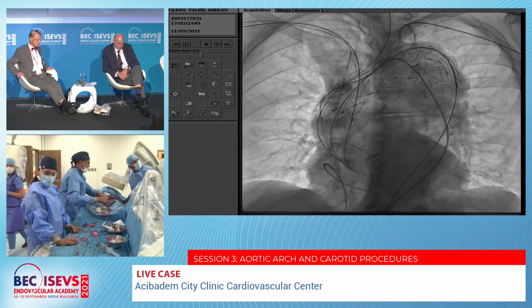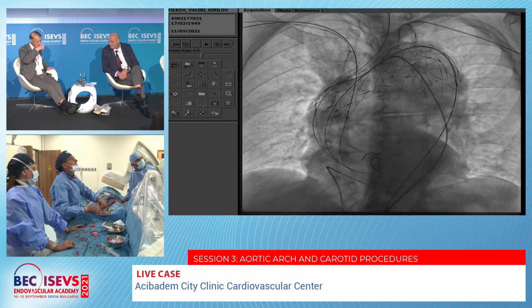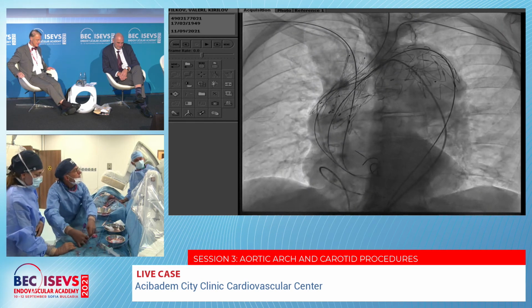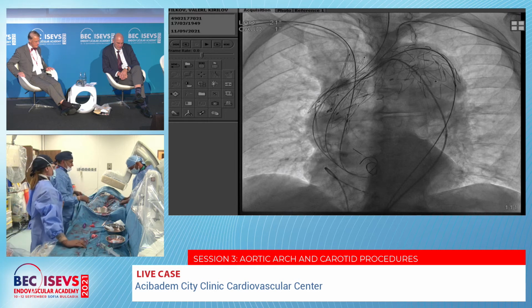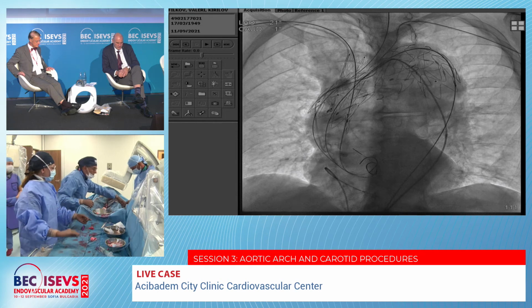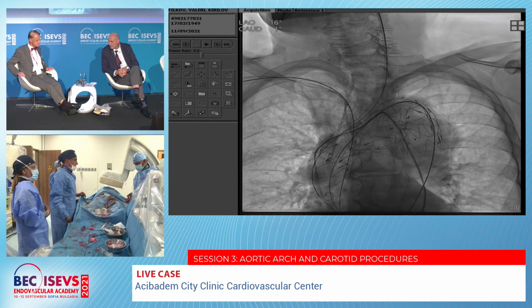Yeah, theoretically you can also coil it, but not with the coils we have seen for the brain arteries, but with these large coils which you can use there. Yes. But the question is why they don't remove all the gear from the other arteries if everything is fine, so why keep the pigtails inside and everything?